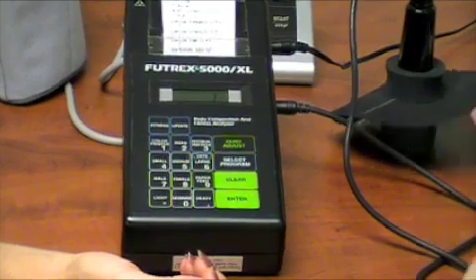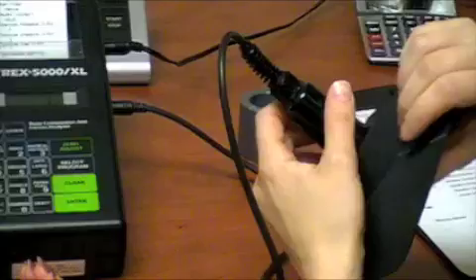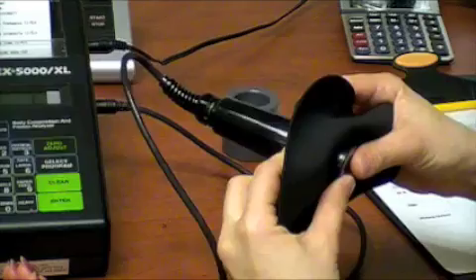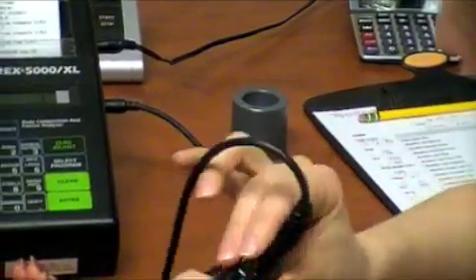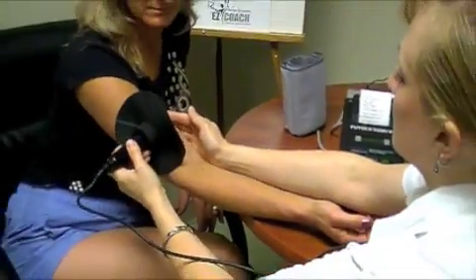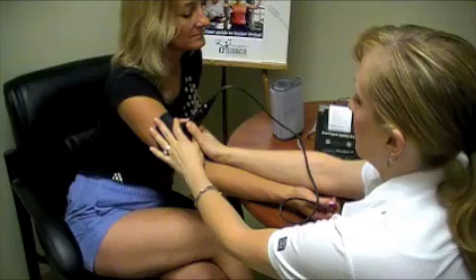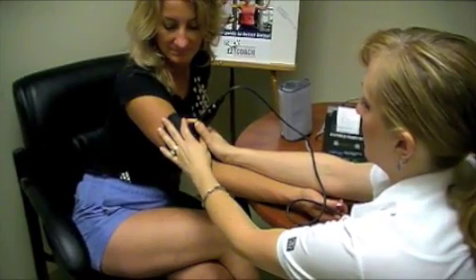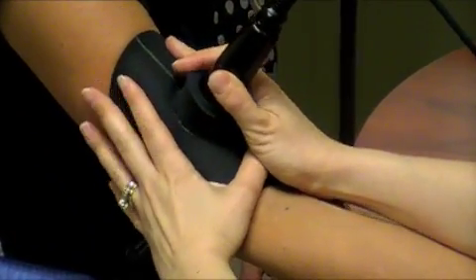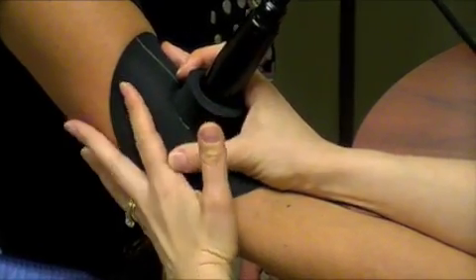Remove the wand from the holder, making sure that it sits 1/8th of an inch lower than the rubber flange. Place the wand on the dominant bicep midway between the elbow and the shoulder. Align the white line on the flange with the upper arm bone. Hold the wand and flange down tight so that no light can escape, and press Enter on the Futrex.